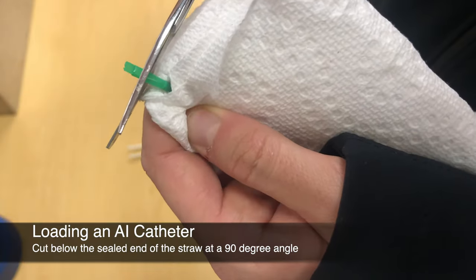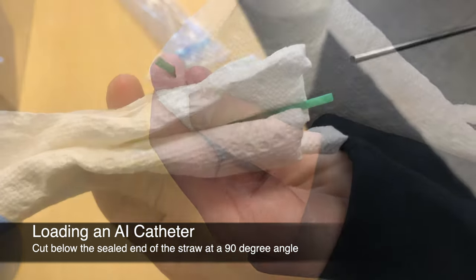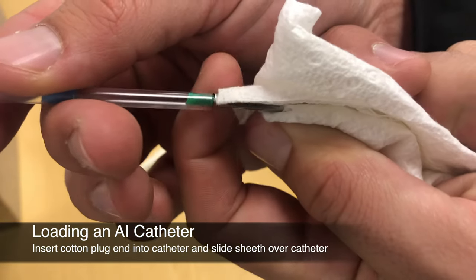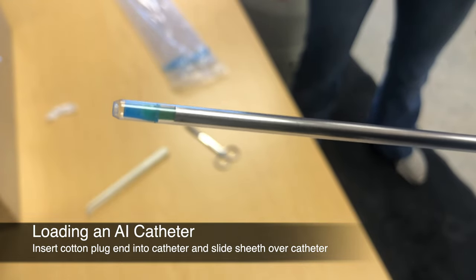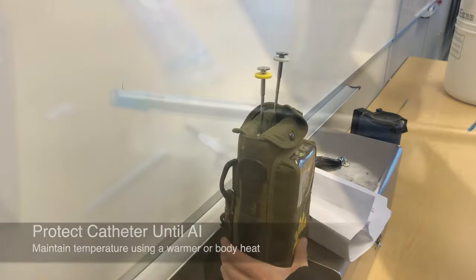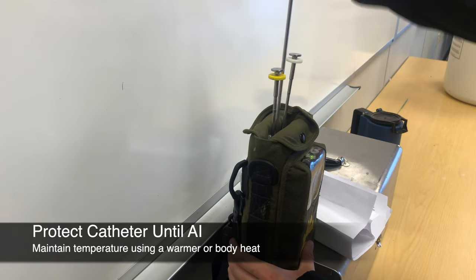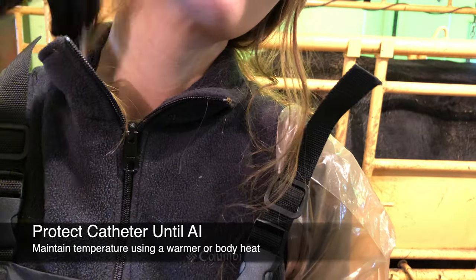Using scissors or a straw cutter, cut a quarter inch below the sealed end of the straw at a 90-degree angle. Insert the cotton plug end of the straw into the AI catheter and slide the plastic sheath over the catheter. Most sheaths are designed with a tip that will lock into place to prevent backflow. Once you have loaded the straw, continue to keep the catheter warm and out of direct sunlight — place it back into the warmer or into your shirt until you are ready to use it.